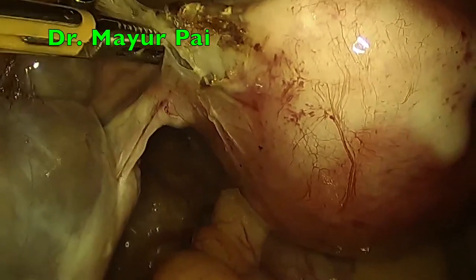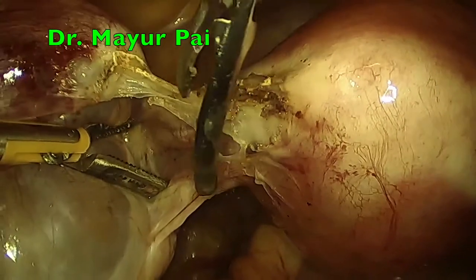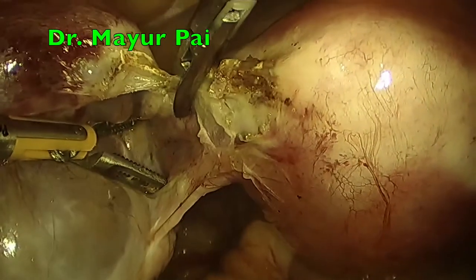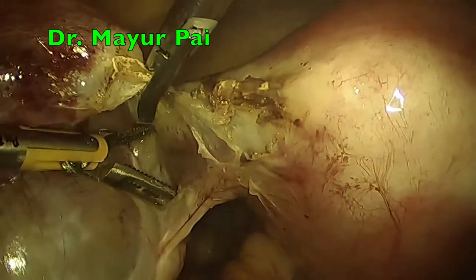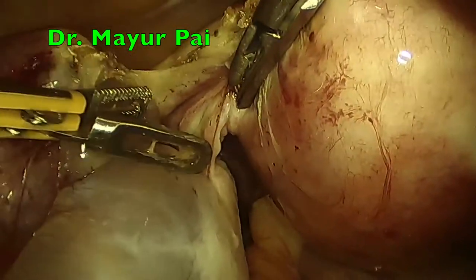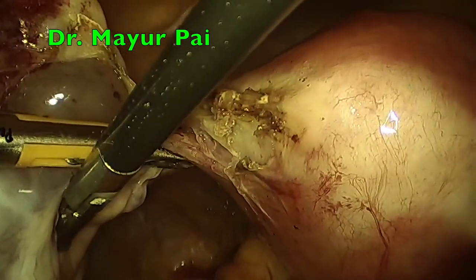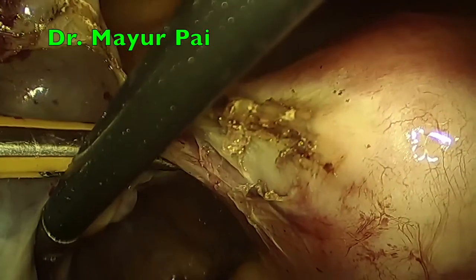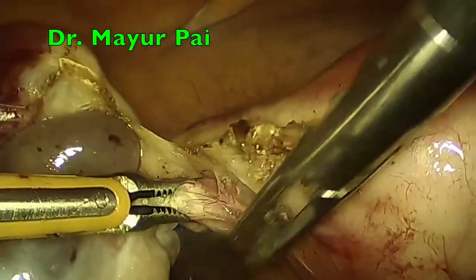So the first coagulation and cutting session was of the fallopian tube. Once we have coagulated and cut this ligament, we have opened the area up, and this helps us in delineating the left-sided ovarian ligament there. So in our left hand we have a bipolar forceps, which is a standard bipolar forceps. Now we are holding the left-sided ovarian ligament with it and we have begun the coagulation.